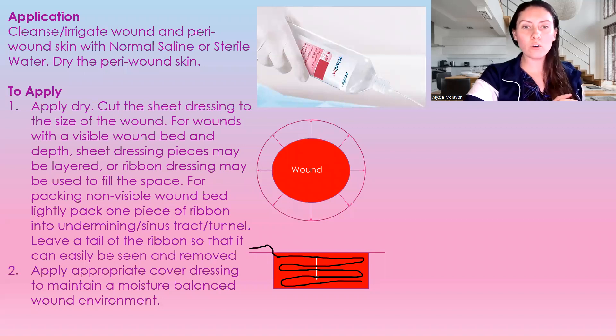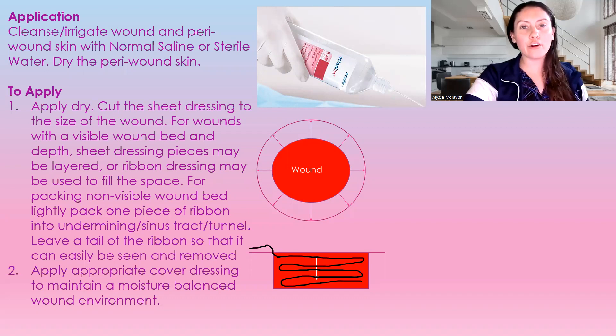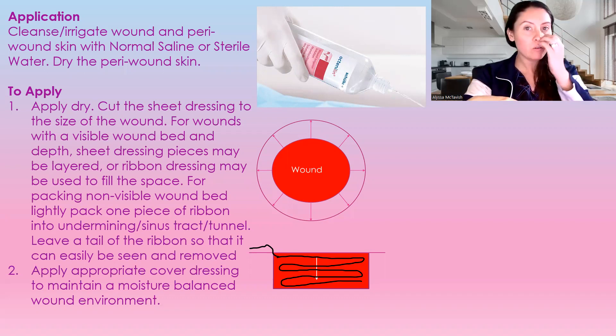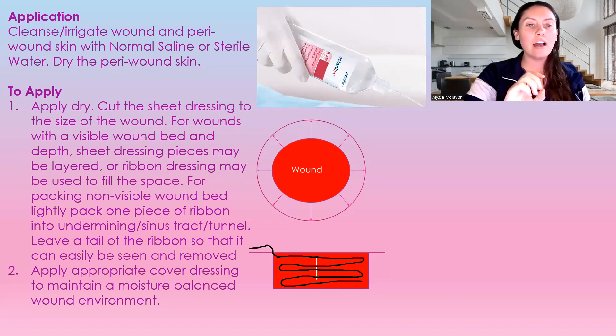When you go to apply an alginate dressing, just like any other wound, you want to cleanse and irrigate the wound and the peri-wound. You are then going to dry the peri-wound with a sterile gauze, and if there is excess fluid in the wound, you can take another sterile gauze and just blot it in there to get the excess fluid.